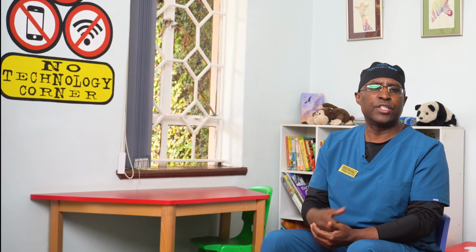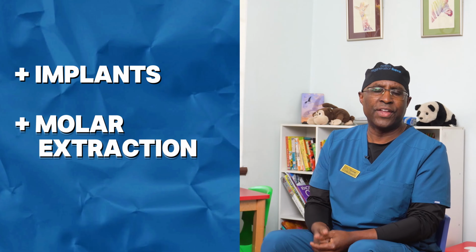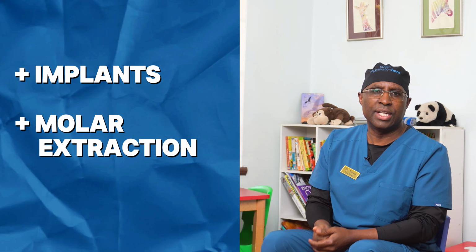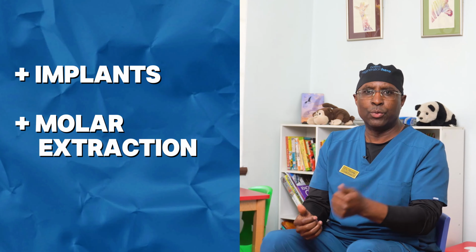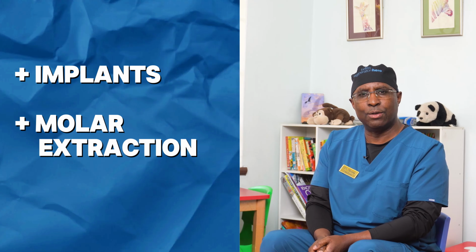So that one is for specific treatments, things like implants, or when you want to remove a third molar that is very close to the nerves and you want to see how the nerve is going. That one, we want to see an exact 3D of how the tissues and everything look like before we can go in and do an operation on you.